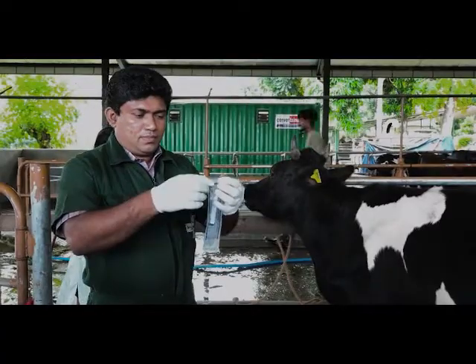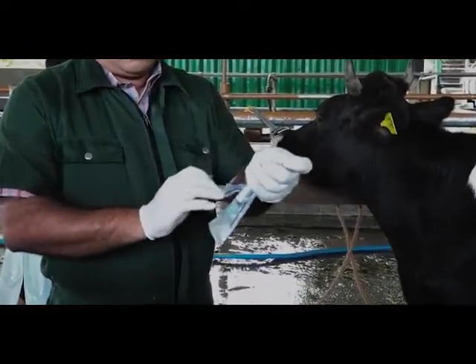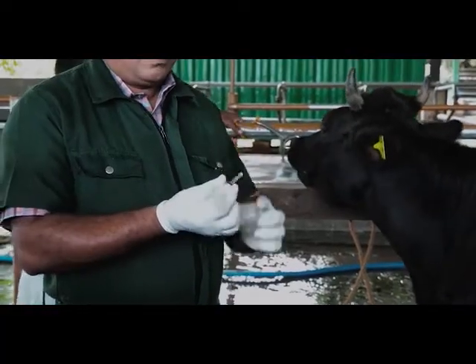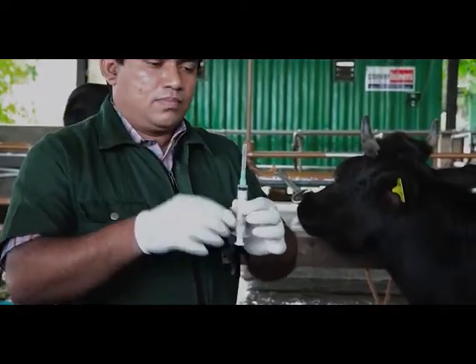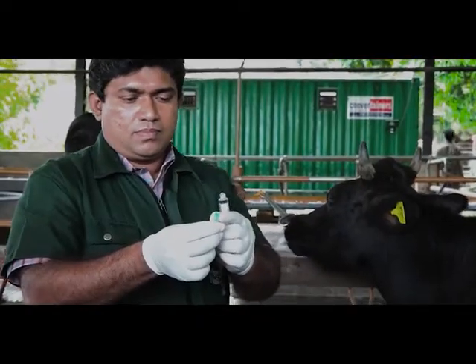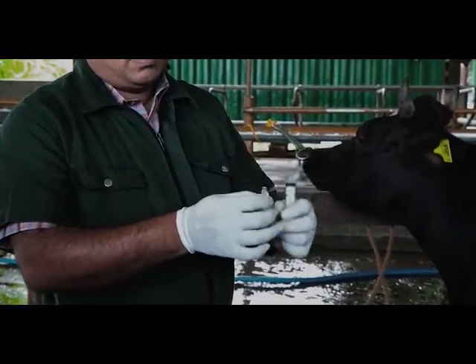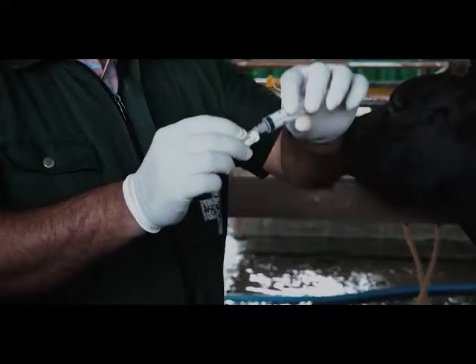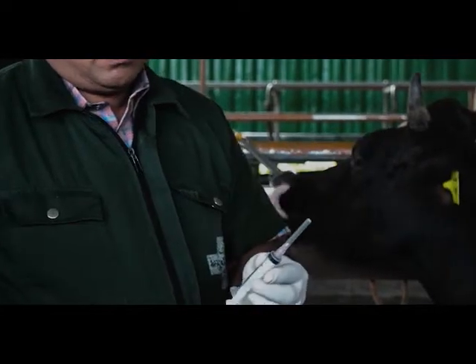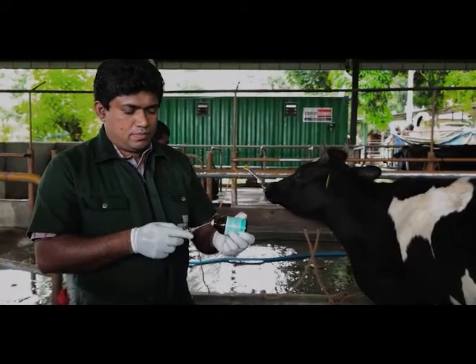To administer the IM injection, I am using a 10 cc disposable syringe which comes with a 21 gauge needle. Because of the thick skin, the 21 gauge needle is replaced with an 18 gauge needle, which would also facilitate jabbing. Let us now load the syringe with the drug.